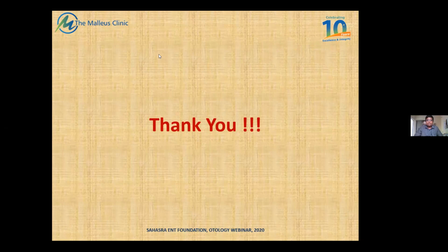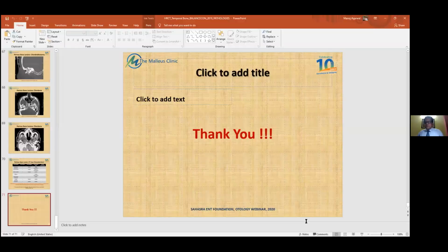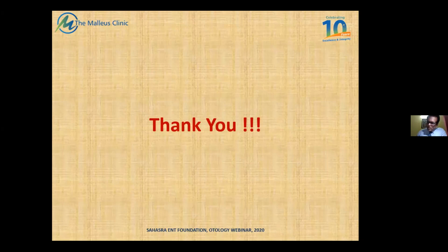Sir, how to decide when we need a contrast or non-contrast HRCT temporal bone? Okay. See, personally speaking, it will all depend upon you. What is it that you want to look at? If you want to look at the bony integrity, do you really need contrast? No. Correct. If you want to look at the bony integrity, you don't really need contrast.